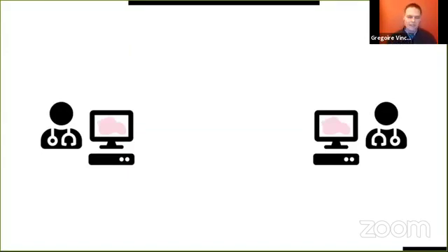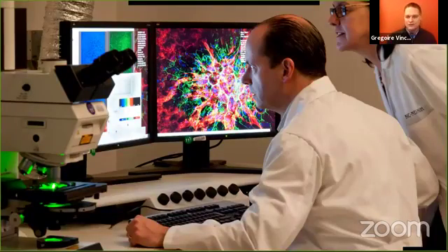So such big images, you cannot share them over internet as easily as an X-ray, MRI, or a picture of your holidays. And sometimes you are not even able to open them on classical computers. So the pathologist needs to have a way to make them travel, generally on a hard disk, and have some supercomputer to make them open. So the collaboration is very difficult, and somehow it drives to no collaboration anymore. And if you succeed to do it, you have to invite your colleague to be no more close to the microscope, but close to the supercomputer.